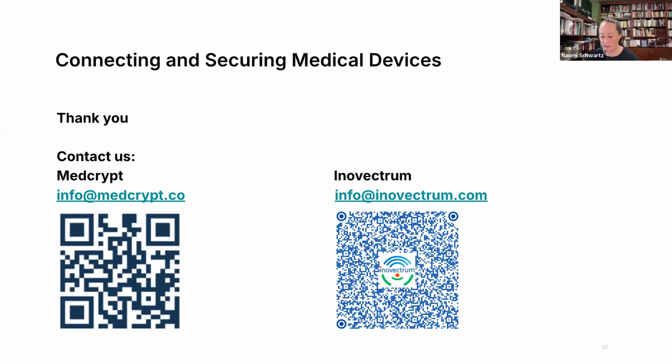The short answer is yes, FDA cares, and they want you to talk about the risks and how you're going to manage those risks. The more complicated answer is, how easy is it for me to crack that case? Internal to Medcrypt, we have a running joke that I zip around with my Dremel tool and grind things open all the time. It's not really a joke, it's true. I'm a hardware engineer at heart and I like working with tools. If I can walk up to your medical device, pop the case open and plug into your USB port, you haven't really protected it.